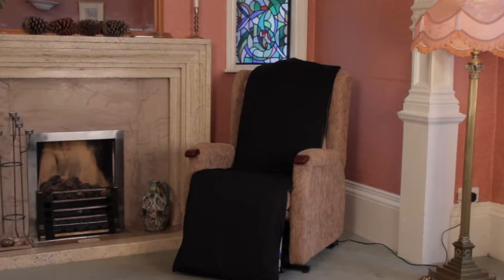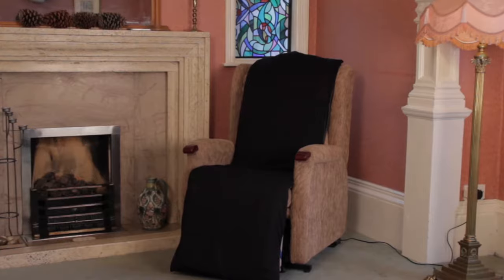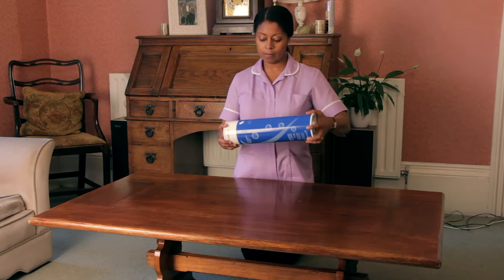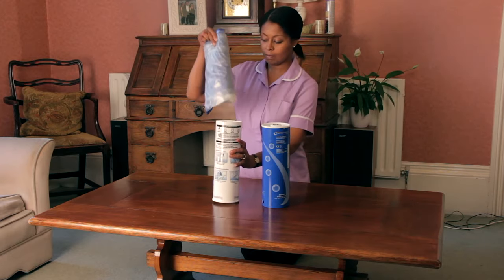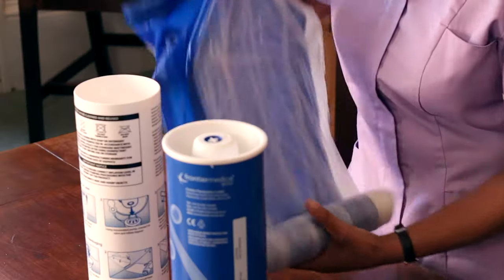The product is in effect an overlay cushion that covers the whole seating area of the chair, including the leg and back sections. The Repose Contour is easy to use and maintain.